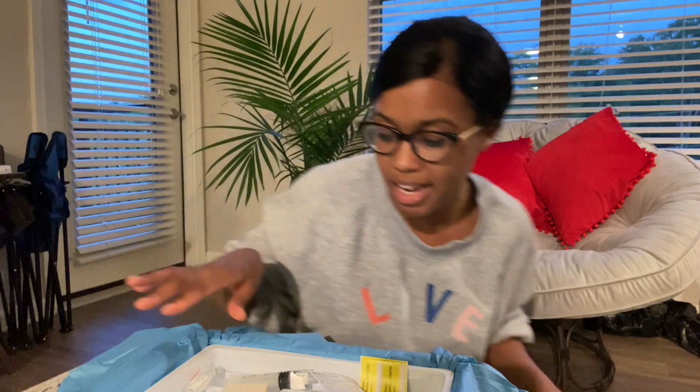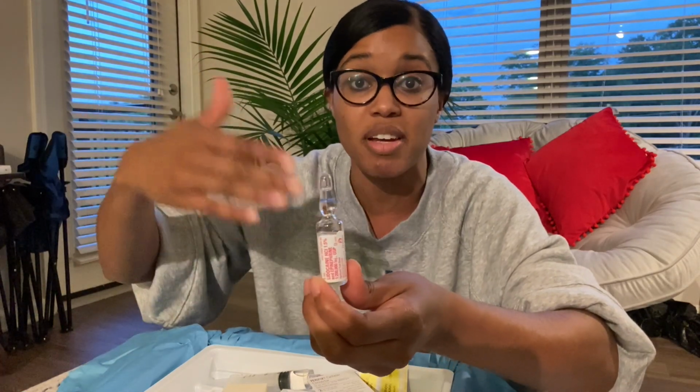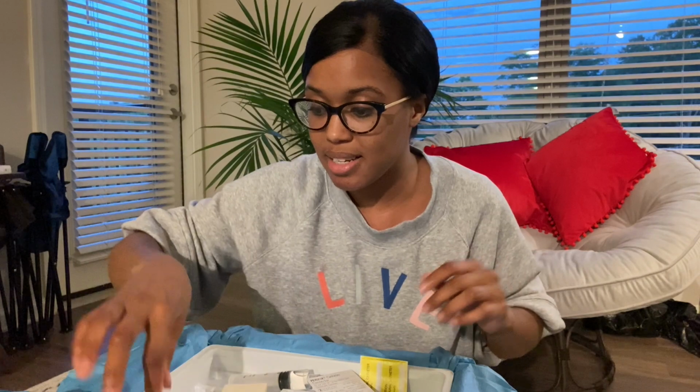And then just some of the medications that we have in the kit. This is some Lidocaine with Epi, and this is what we use to do the test dose. After we believe that we got into the epidural space, we use this to make sure that we're not in an artery or vein, and this helps us figure out if we're in the right spot before starting a drip or giving a bigger bolus, because that could be dangerous. So that's a nice safety measure.